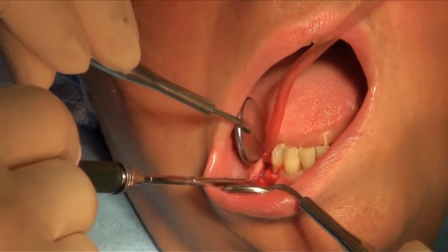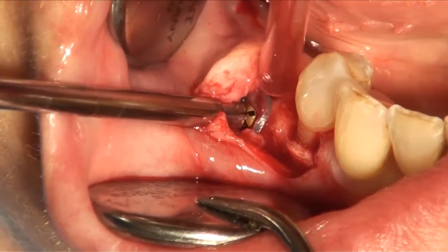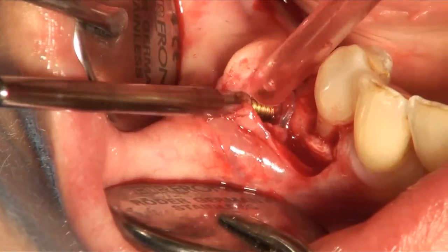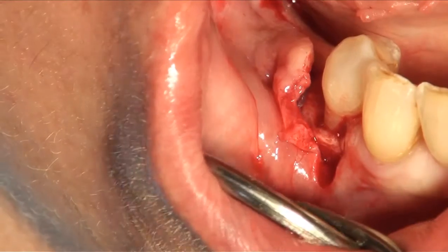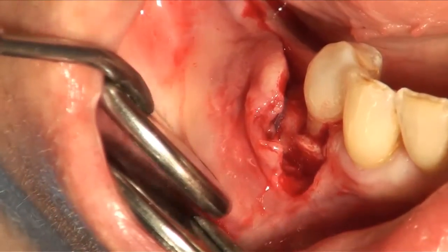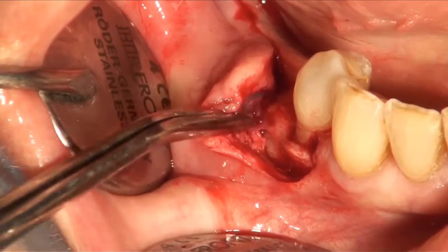Here my screwdriver comes along, and you see now the screw is removed. And now I will remove this expander out of the pouch.